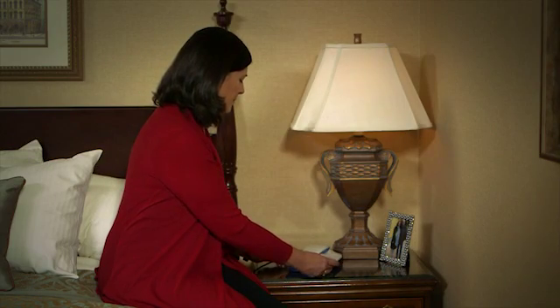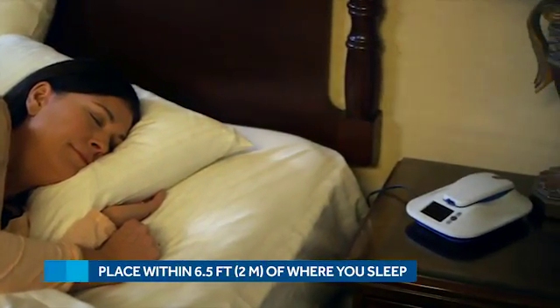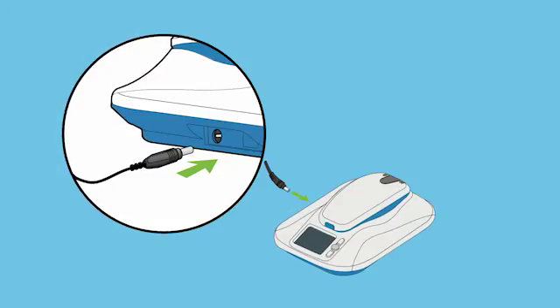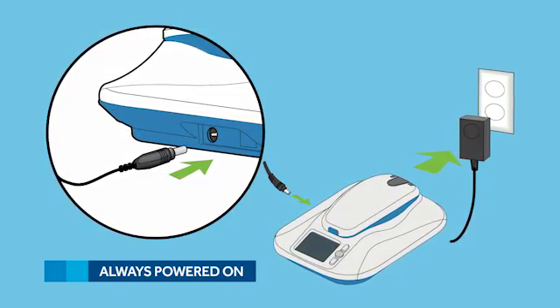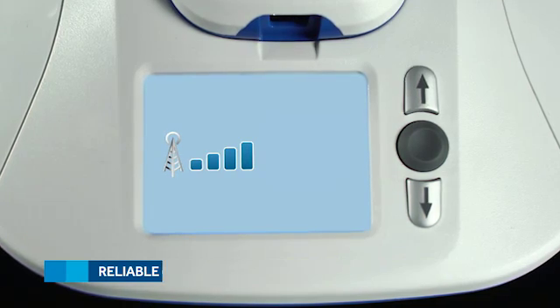First, find a good place to keep the MyCareLink monitor. It should be placed within six and a half feet, or two meters, of your bed. This is because your doctor will program your Reveal Link device to send information to the MyCareLink monitor at a time you're usually sleeping. Plug it into a standard power outlet — make sure it's one that receives constant power, and avoid an outlet controlled by a wall switch since it could accidentally get turned off. Make sure the location you choose receives an adequate cellular signal. A bedside table should work perfectly.